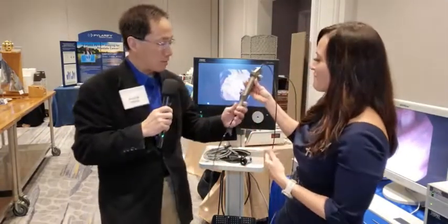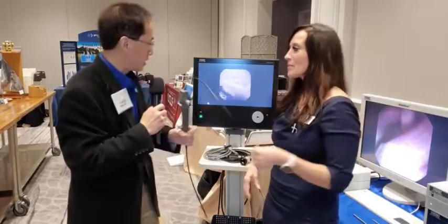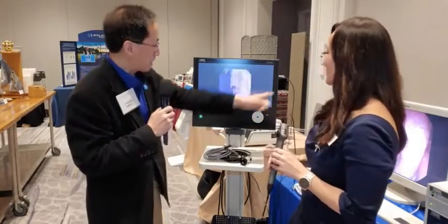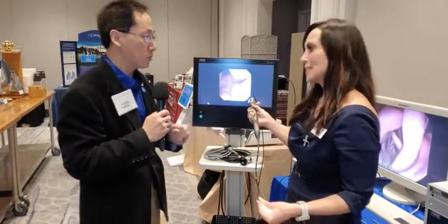There's only one thin little cord right here — that's the only thing you have to plug in. It's like an all-in-one computer; you just plug it into the side and you get a nice image. It's a very portable unit — good for the office and good for the surgery center.